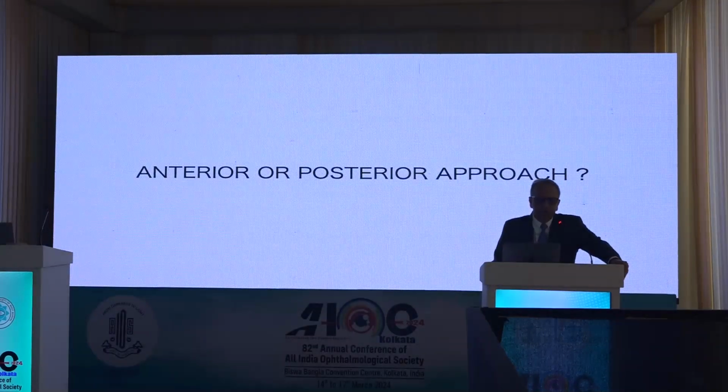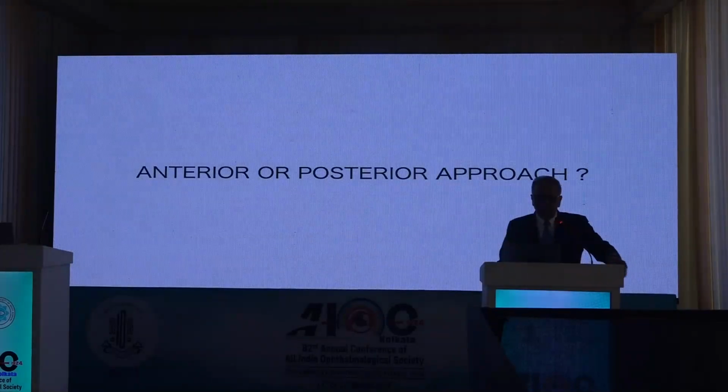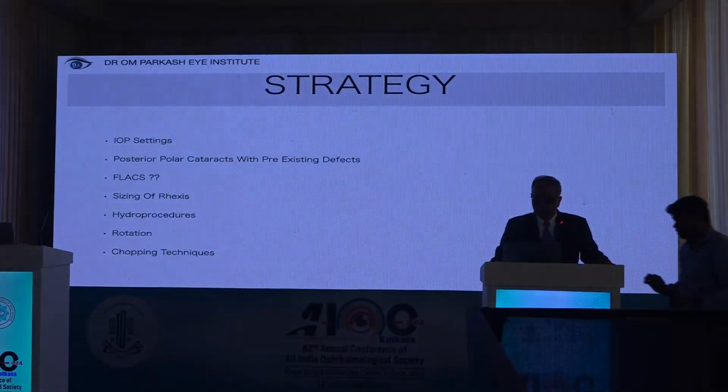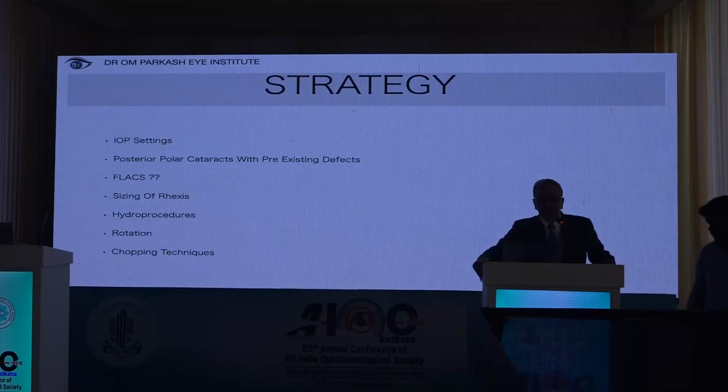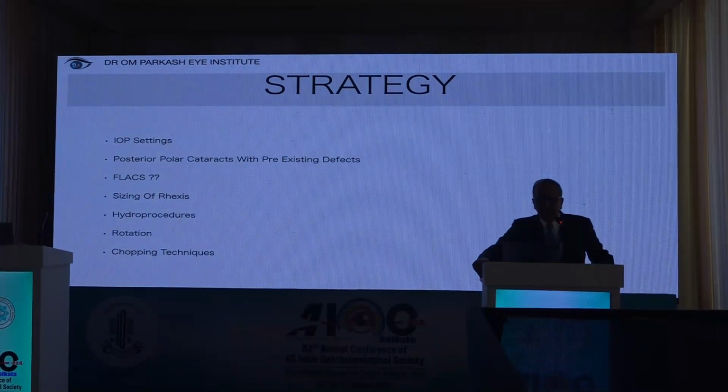Now the question was whether we should go in for an anterior approach or a posterior approach. Well, with the new machines and new fluidics, we went in for the anterior approach. So the strategy was to use low IOP settings, as has been propagated by Bob Osher and Abhay Vasavada. Consider the patient as a posterior polar cataract with pre-existing defects.